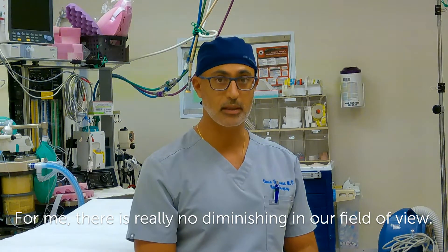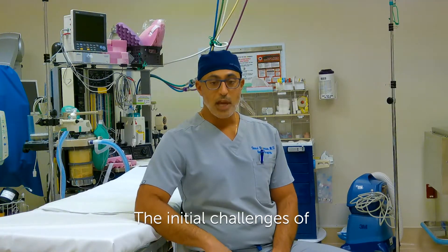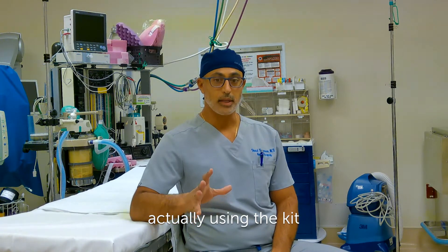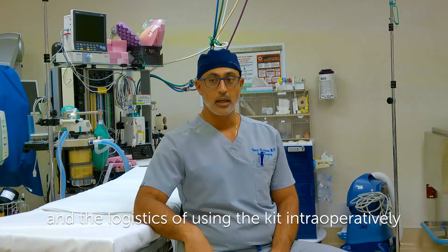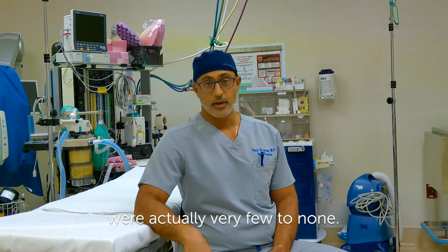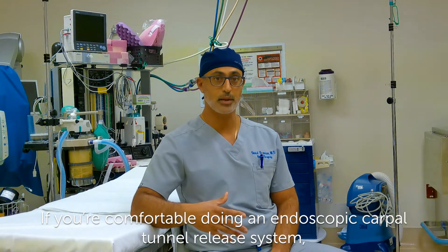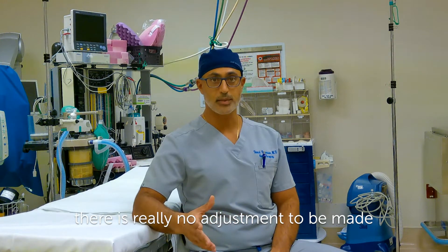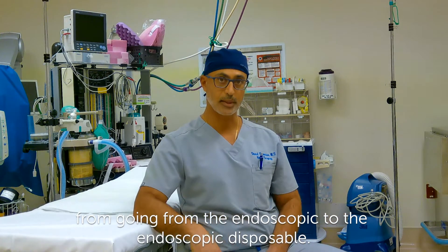For me, there's really no diminishing in our field of view. The initial challenges of actually using the kit and the logistics of using the kit intraoperatively were actually very few to none. If you're comfortable doing an endoscopic carpal tunnel release system, there is really no adjustment to be made going from the endoscopic to the endoscopic disposable.